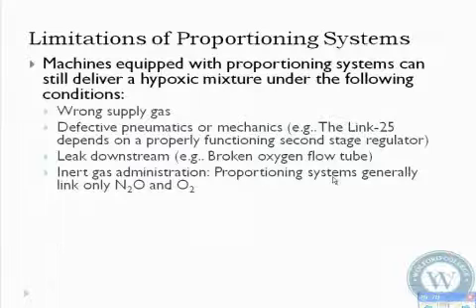Okay, it doesn't work if you screw the pipelines up. So if you put the wrong gas on the machine, it doesn't know that. It's simply a mechanical device, okay? So it will not detect anything wrong.